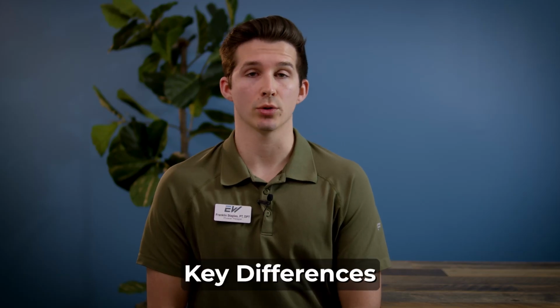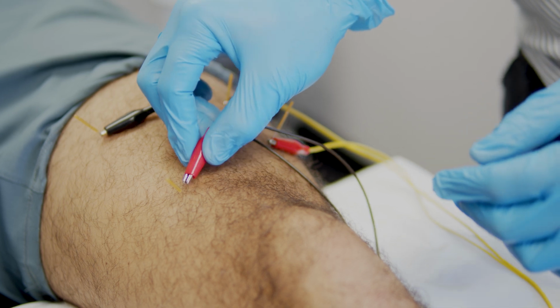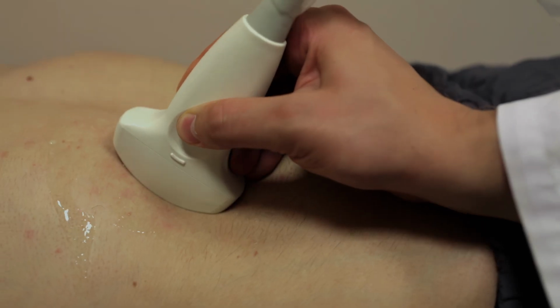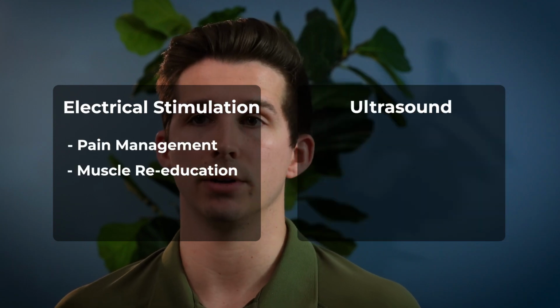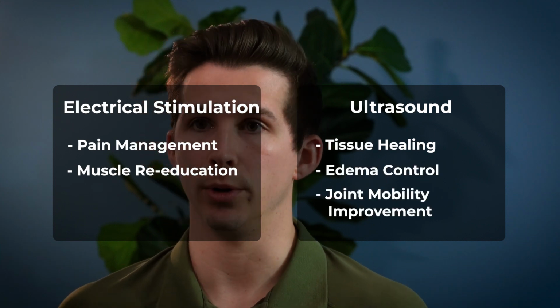Electrical stimulation and ultrasound have some very key differences. One is the application. One uses stim pads or even dry needles in terms of electrical stimulation. The other utilizes a specific crystal that then uses sound waves via ultrasound. The other key differences between the two are the different demographics they're used for, as well as the different precautions associated with each. Electrical stimulation can be used for pain management as well as muscle re-education, whereas ultrasound is going to be used more for tissue healing and edema control, as well as joint mobility improvement.